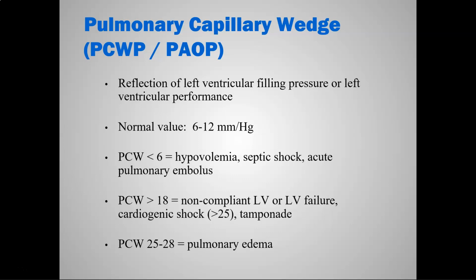And then potentially, if it was more acute onset and there's some trauma associated with the onset of this increased wedge pressure, or if there was potentially infection or sepsis indicated with the onset. And this is rare. You don't usually see an increase here because of sepsis.